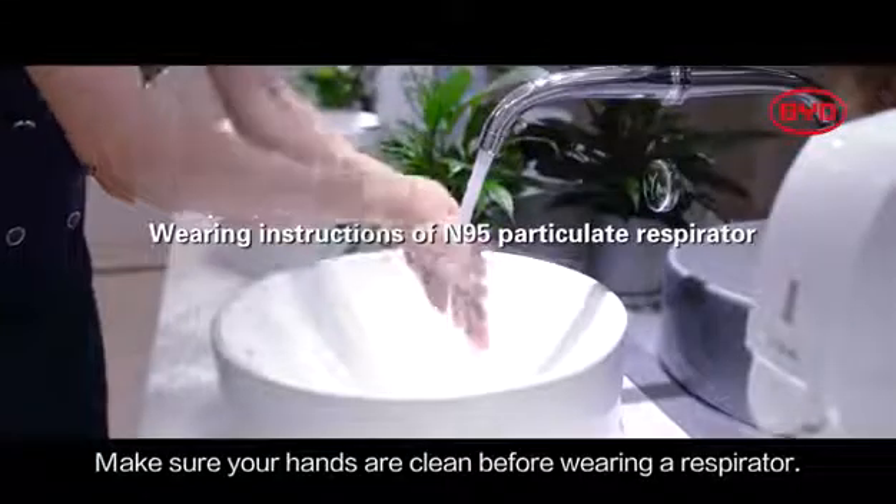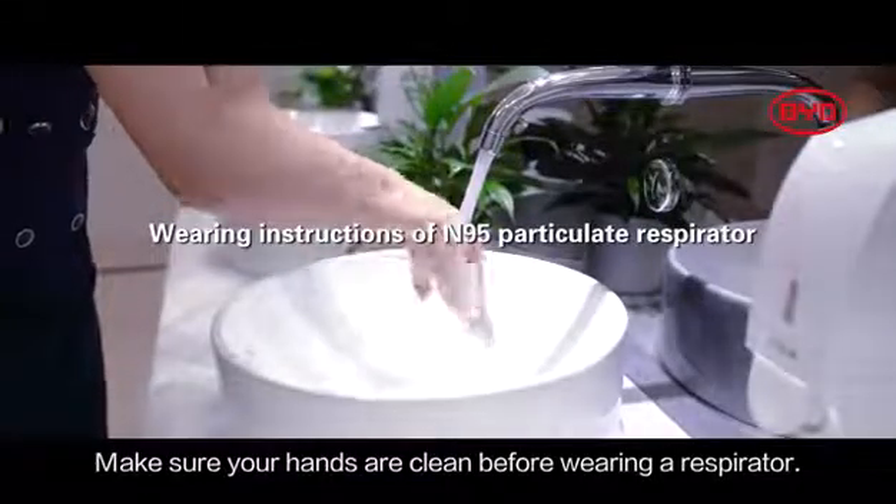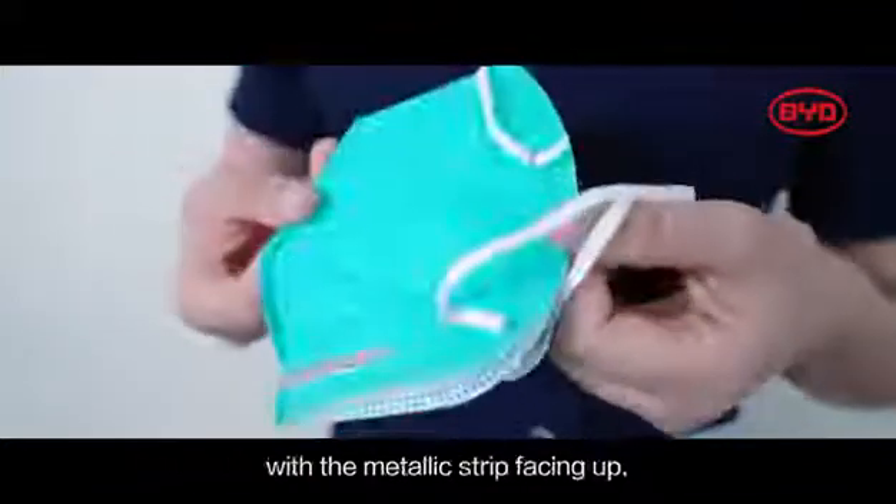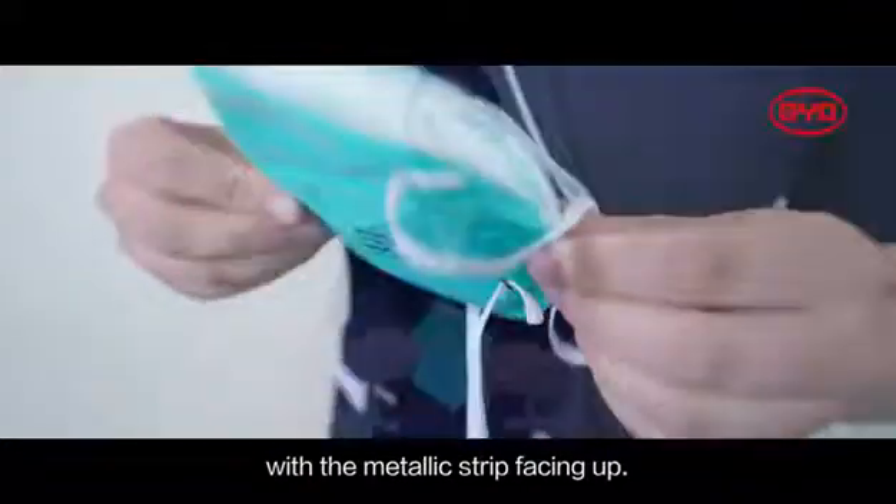Make sure your hands are clean before wearing a respirator. Unfold the respirator and hold it with both hands with the metallic strip facing up.